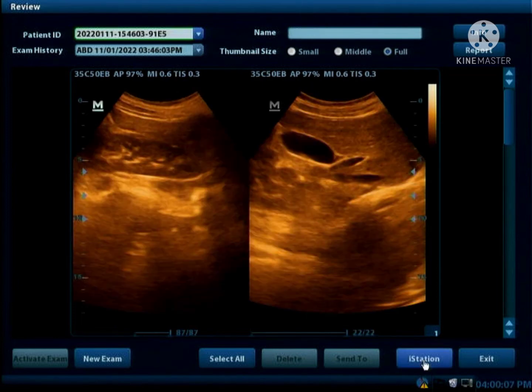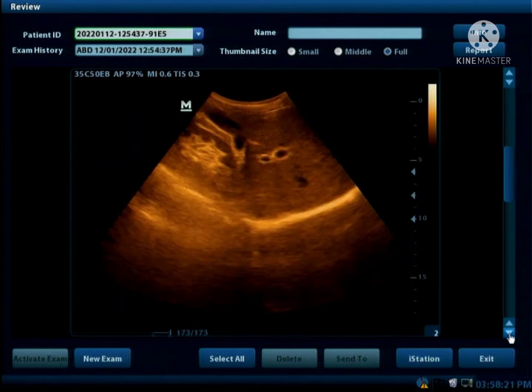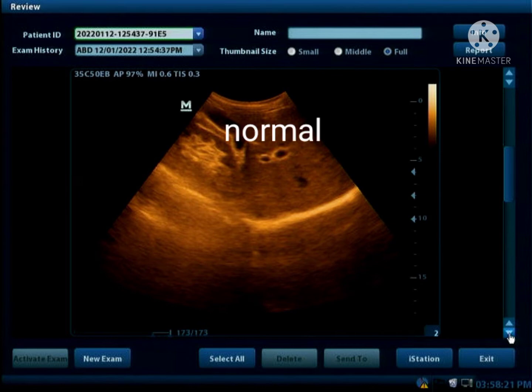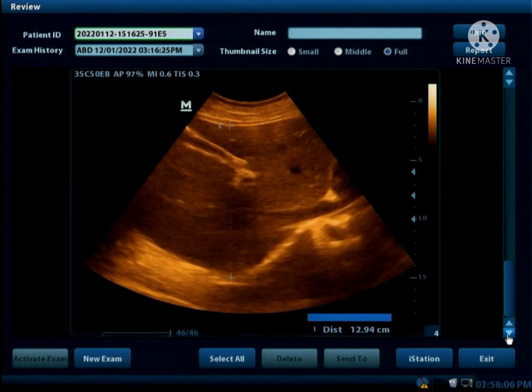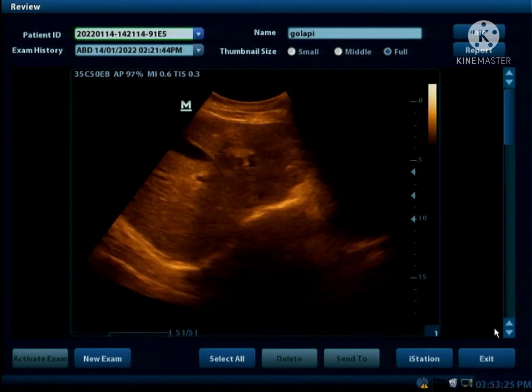This is almost a normal liver. This is also normal. Again, it's normal.